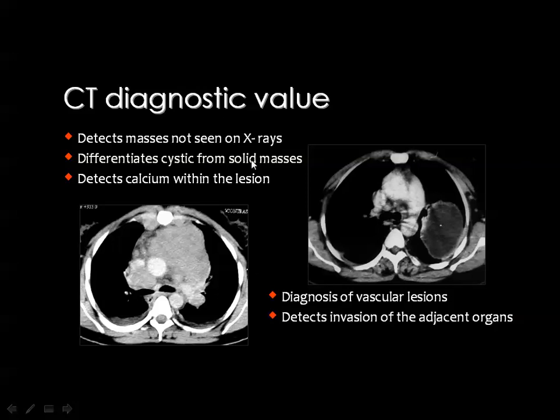First of all, you should know that the plain film has a weak diagnostic capability in evaluation of most of the mediastinal pathology. Actually, it's good for evaluation of lymphadenopathy, particularly the hilar lymph nodes, and maybe some of the neurogenic tumors, but it is a general rule that the plain film has a weak contribution for mediastinal evaluation.